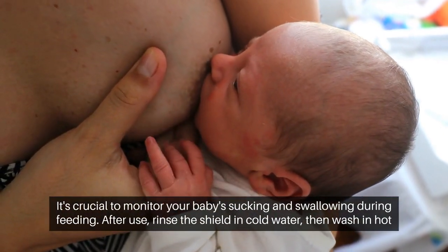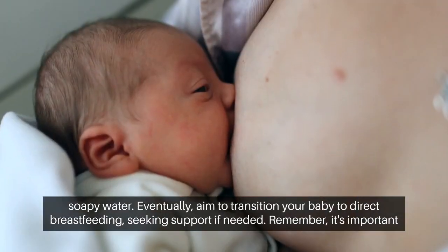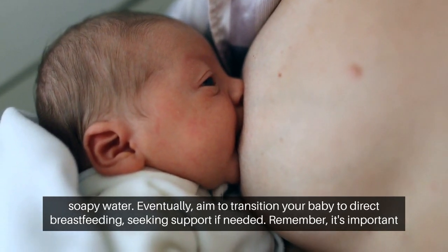After use, rinse the shield in cold water, then wash in hot, soapy water. Eventually, aim to transition your baby to direct breastfeeding, seeking support if needed.